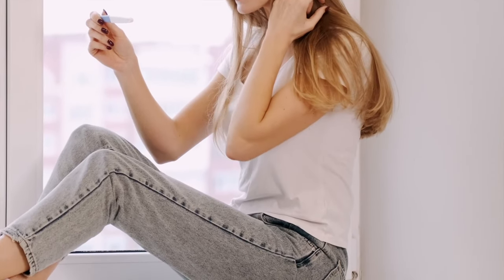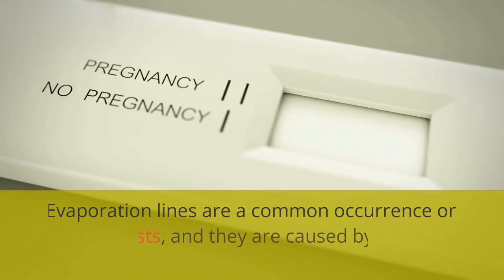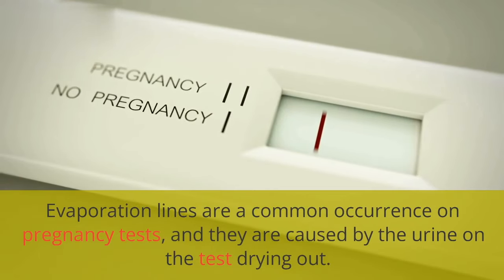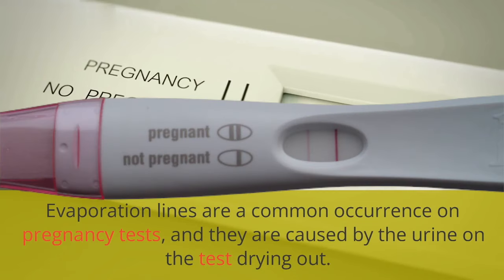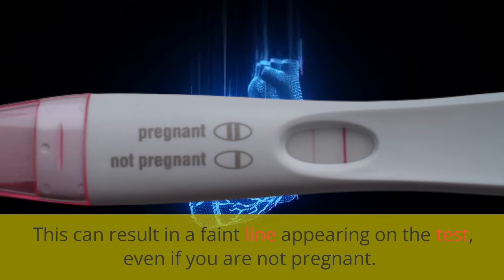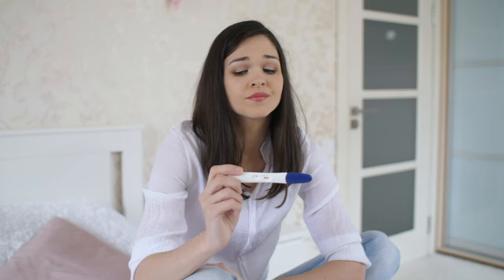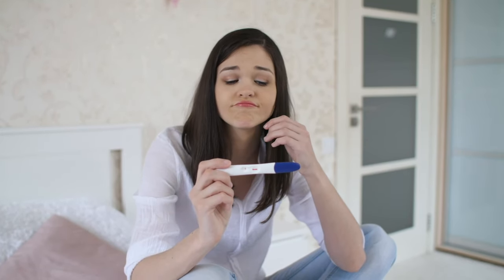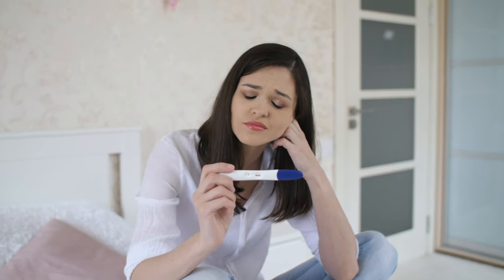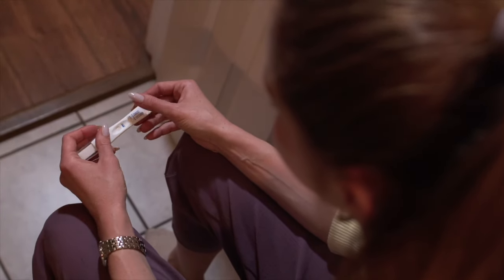So let's get started. Let's first understand about the faint line and when it will give you the positive pregnancy result. So you have performed your home pregnancy test, taking your first urine of the morning, and you have put 2 or 3 drops as instructed at the place instructed in the kit, and you have got the result after the time as written in the instruction of the kit. This wait time can be 3 to 5 minutes. It depends on the brand. That means after putting the urine drops in the kit, you have to wait for a certain amount of time. It could range from 3 minutes to 5 minutes, and this time is written in the instruction of the kit.